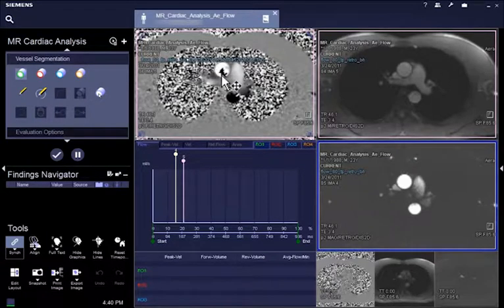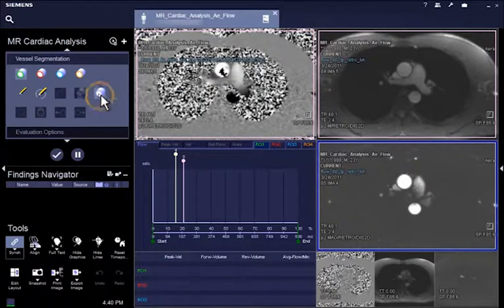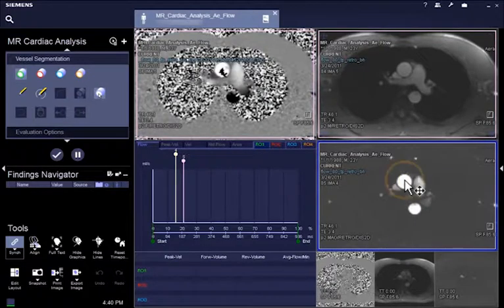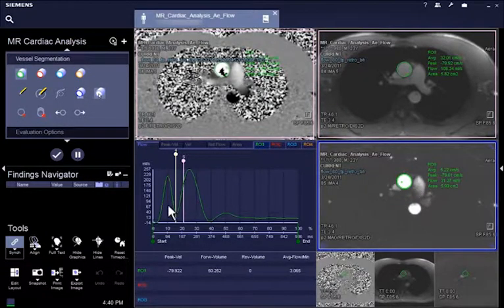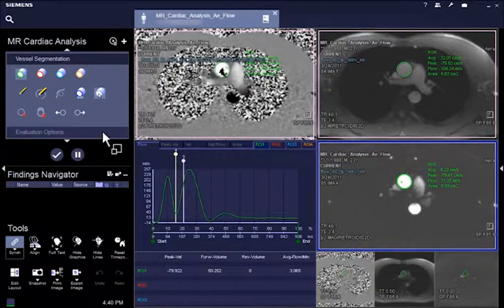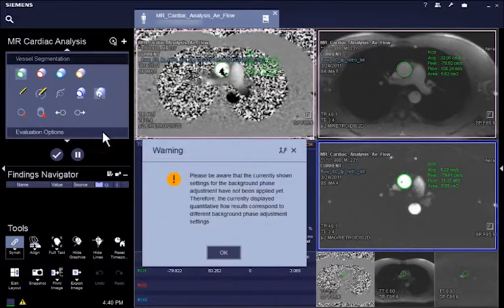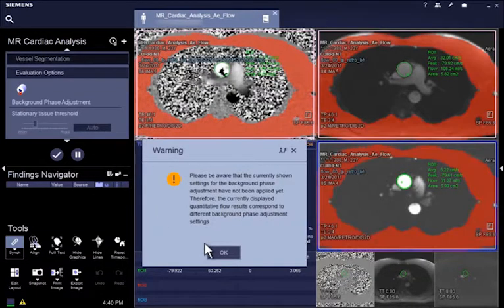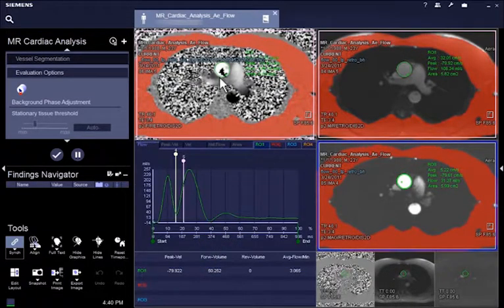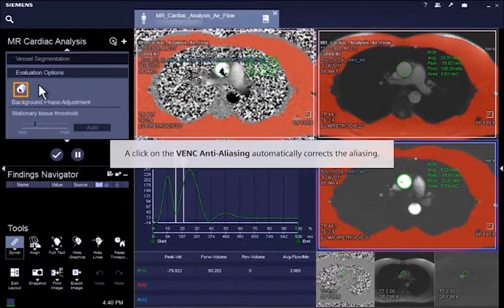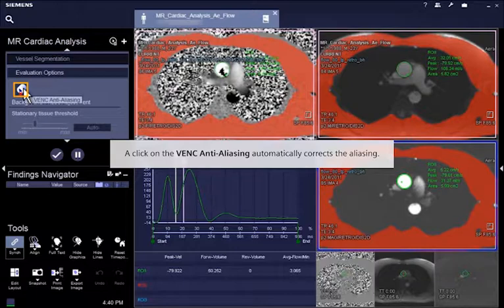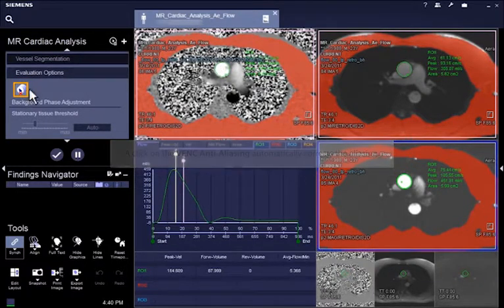Optional evaluation tools are available under Evaluation options, for example if aliasing is seen on the images due to a measured maximum flow velocity higher than the encoded flow velocity. A higher maximum flow velocity might result in dark or bright spots in the ascending or descending vessels. A click on the VENC anti-aliasing automatically corrects the aliasing.